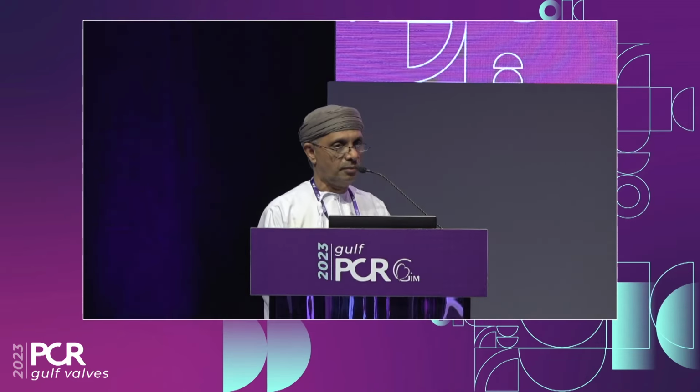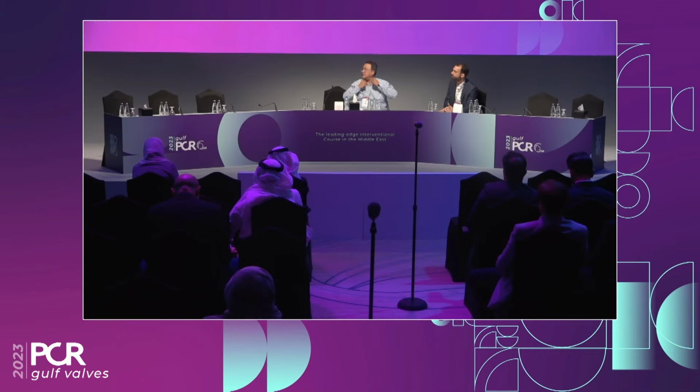Any question, comment? So what was the gradient here at the end of the procedure? 3. Okay. And another misconception, this is an intra-annular valve, but however, it has a gradient performance of a supra-annular valve. The shape and design of the valve, the height of the leaflets, and the way they're sutured gives you hemodynamics of single digit in almost all cases.